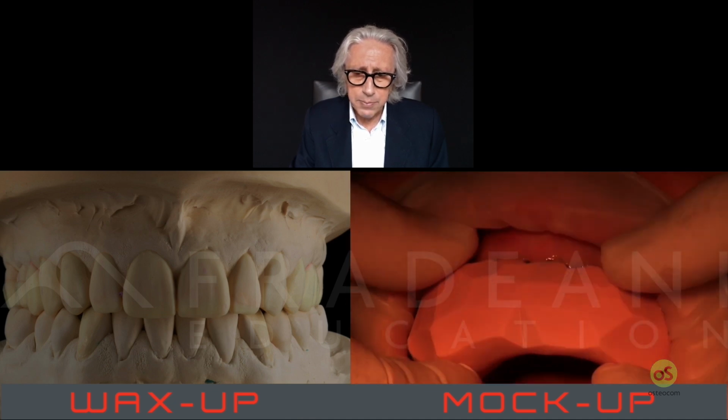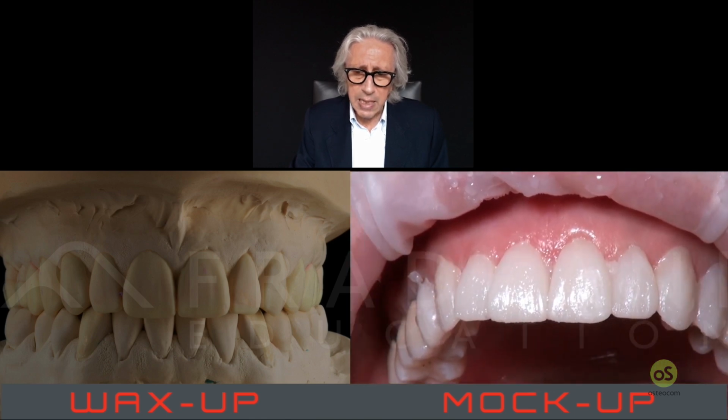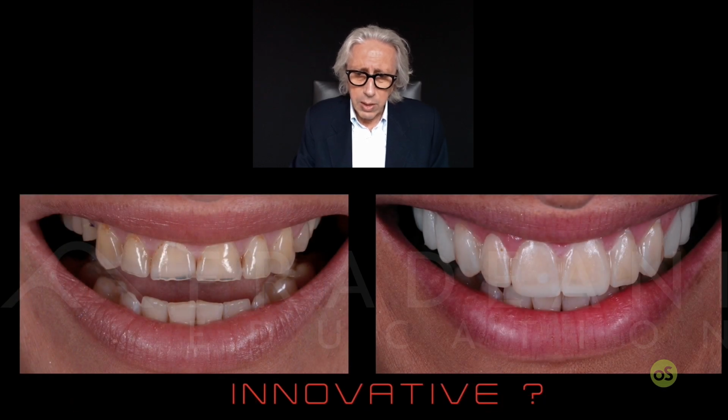be the final outcome, so the patient can check it, but not just check the new length, not just check the new mock-up, but also look with the mock-up whether the lower teeth are still going edge to the upper, because they will touch in the part that was already elongated. Once you did it at the beginning, maybe she is also having this kind of impact with the lower incisor to the upper incisor, because the movement was the horizontal movement.